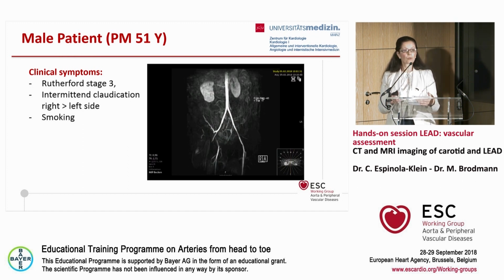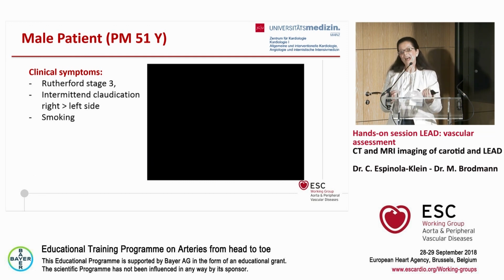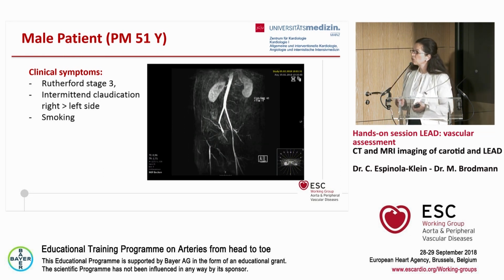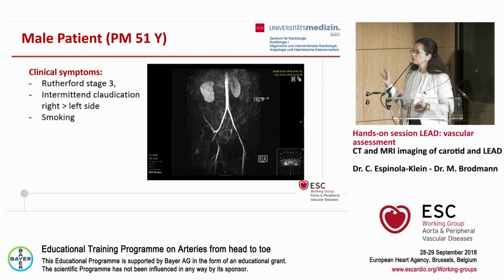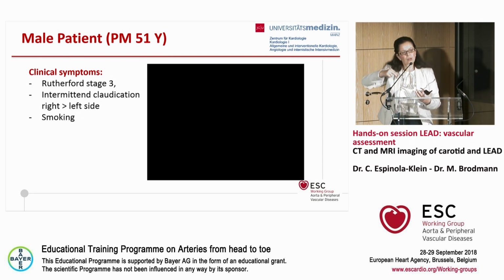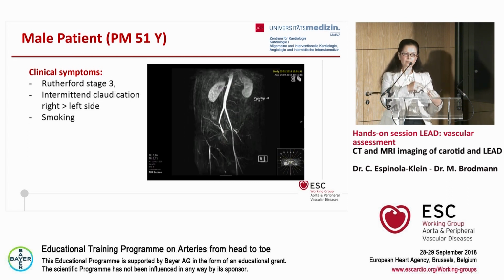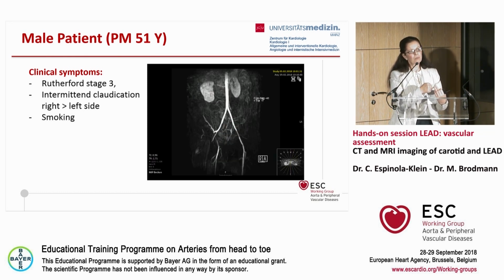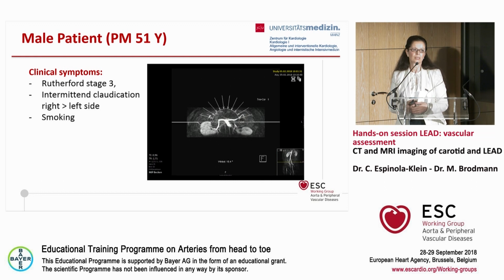We can also have problems with flexible stents, such as the Supera stent, because this stent can have acute occlusions if the patient is sitting for a longer time, and therefore I discussed this very hard with our surgeons, to avoid stenting in this area. When we perform a revascularization and we are in the subintimal channel of the vessel, we have to re-enter the lumen, and then it might be too late, down in the common femoral artery.